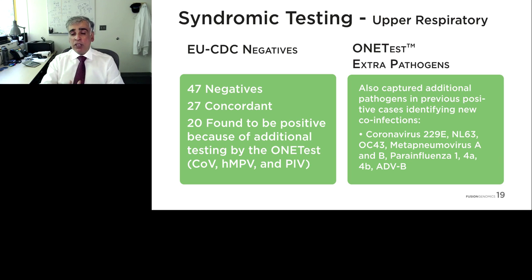And also, we were able to capture additional pathogens, again, pathogens that either cannot be tested because of the complexity of the assays or the sheer number of reactions you would have to do. Even in previously identified infections, we were able to identify new co-infections which belong to anywhere from corona to metapneumo, parainfluenza, and ADV.